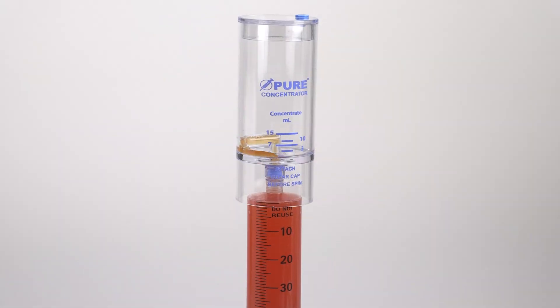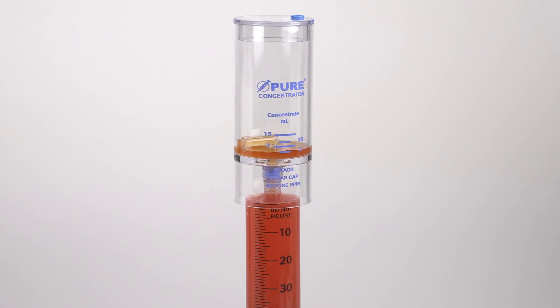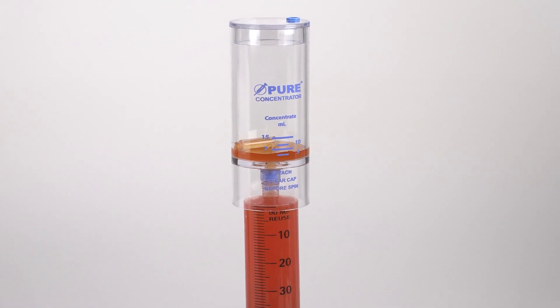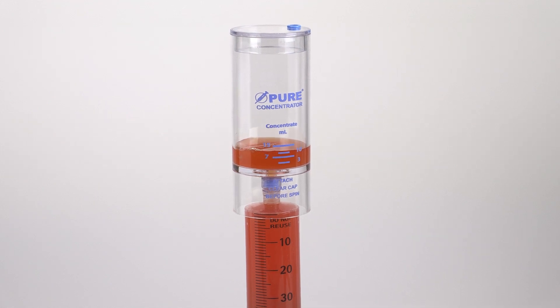Remove the clear cap from the concentrator device. While holding the concentrator device in an upright position, transfer the platelet plasma suspension from both separator devices into it.